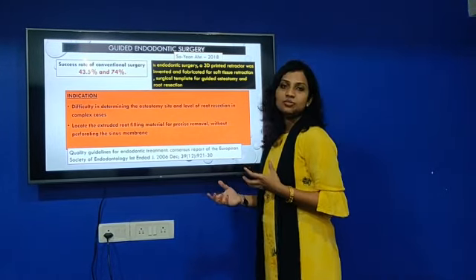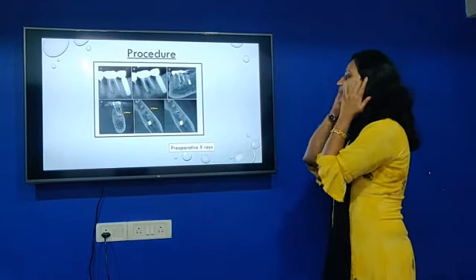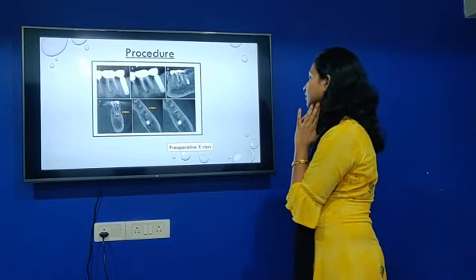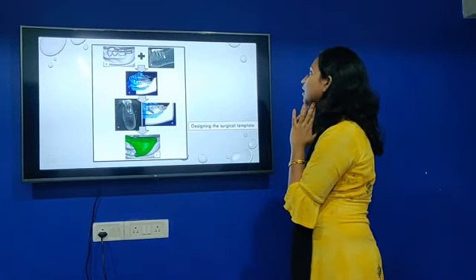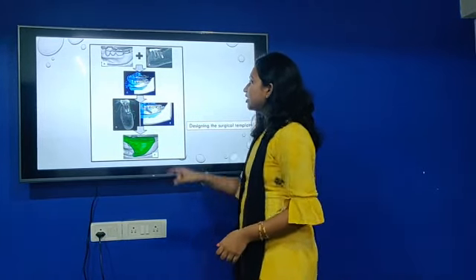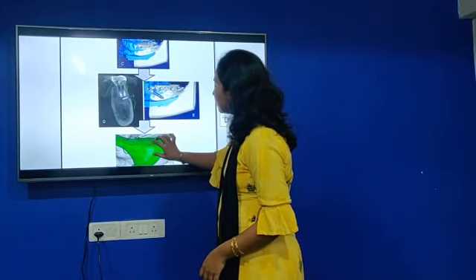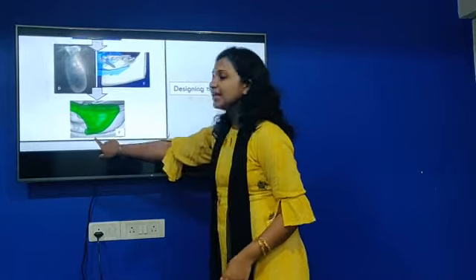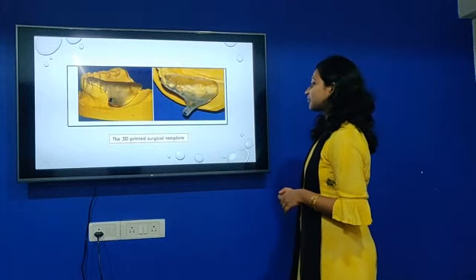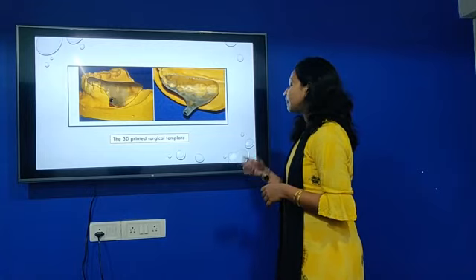The procedure: first is pre-operative evaluation of the lesion. For the molar, a drill has been fabricated and virtual planning is shown. You can see the surgical template beautifully designed — even the path is designed to show where the osteotomy will be performed. Clinically, the 3D-designed template is obtained, and the instrument is inserted through it.